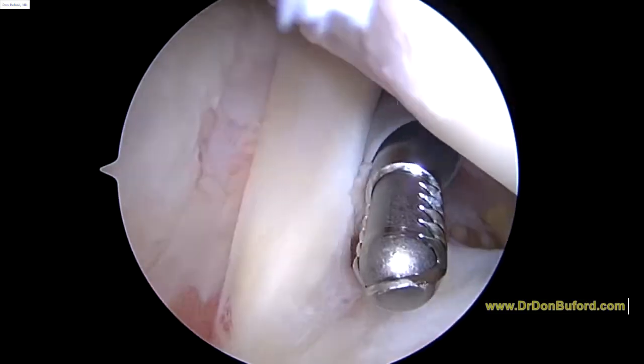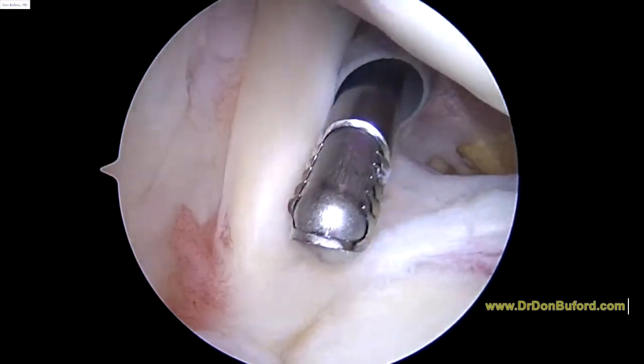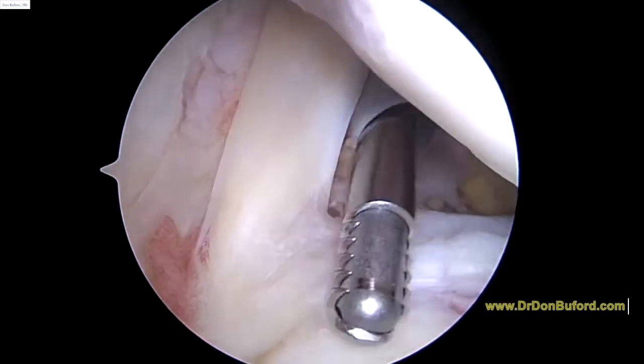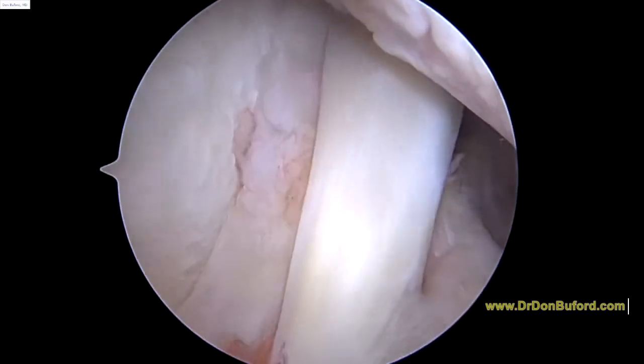Hey Derek, it's Dr. Buford. We're just getting started on the right shoulder. We're looking at it from the back to the front. Everything you see is magnified 30 or 40 times on the screen. I know you're kind of an old pro at this, so we're going to go through this and just show you the anatomy. Here's the biceps tendon. Looks good.